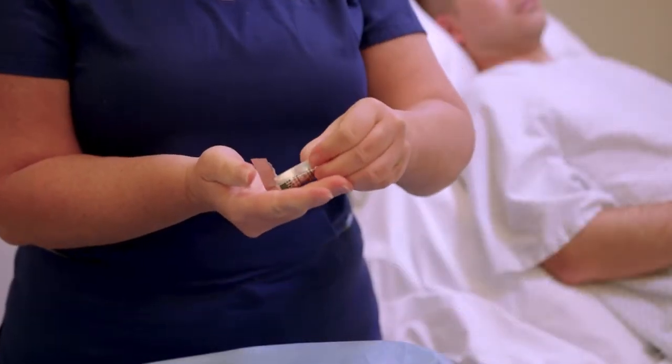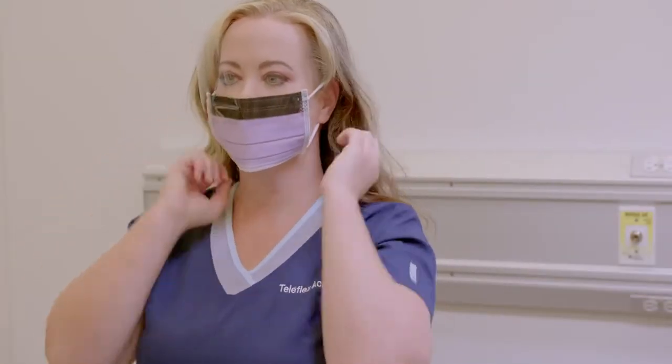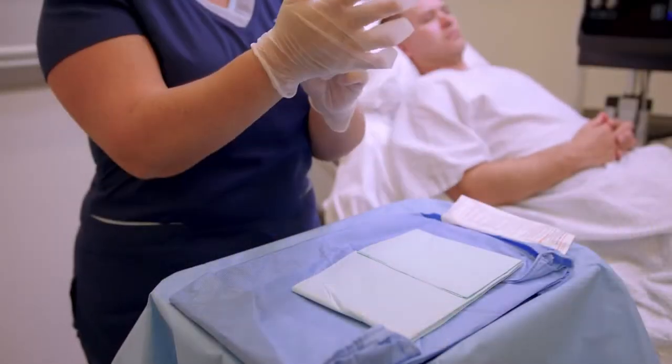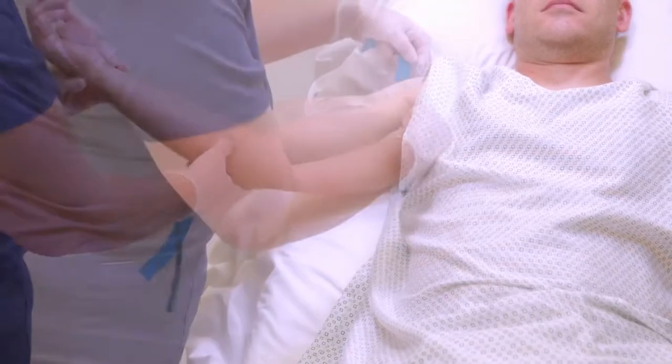Cleanse hands with alcohol-based hand gel. Open procedure tray and don hair cover, mask with eye protection, and non-sterile gloves. Place a tourniquet underneath the patient's upper arm.